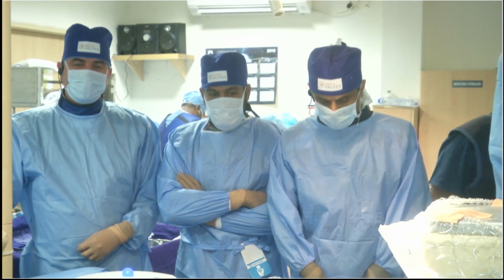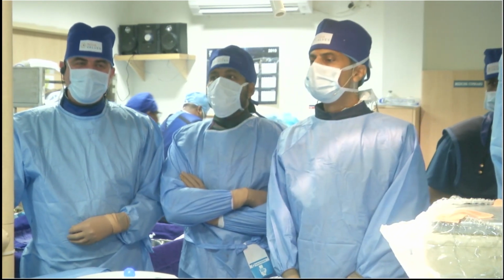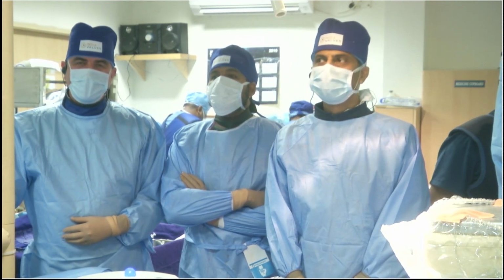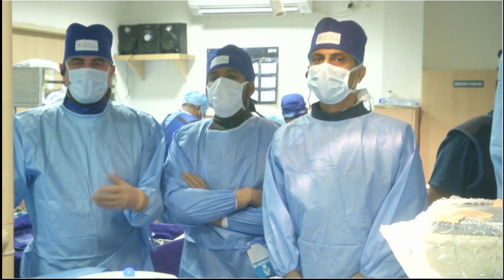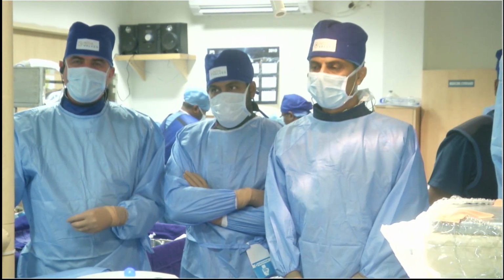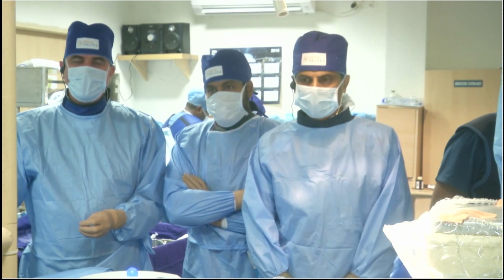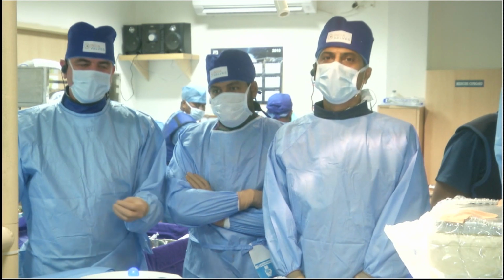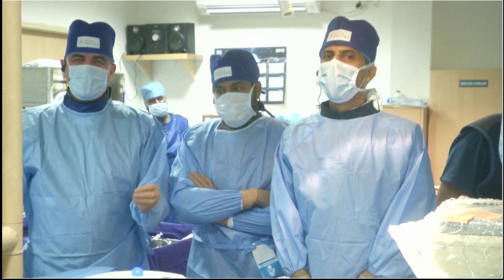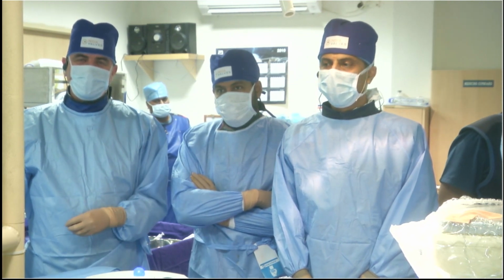Absolutely. It's a great pleasure to be here with you from the cath labs here in Apollo. There's already a feeling of a very confident and established team here. What we would like to do is to allow you to present the case in the arena there, have some discussion regarding the technical aspects of this procedure, and then when you feel you're ready, we can start the case. We're just going to go very steadily, step by step, through the ABC of a TAVI procedure for the benefit of the main arena audience.